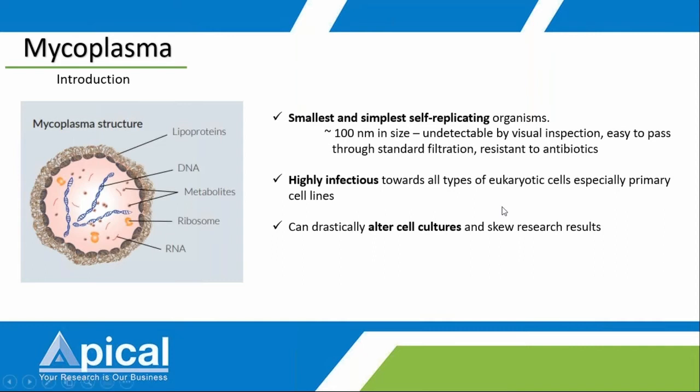It has the ability to attach to a single cell, fuse to the cell membrane, multiply, and outnumber the cell culture by 100-fold. That is why it drastically alters the cell culture itself, and a lot of the time it skews the research results.